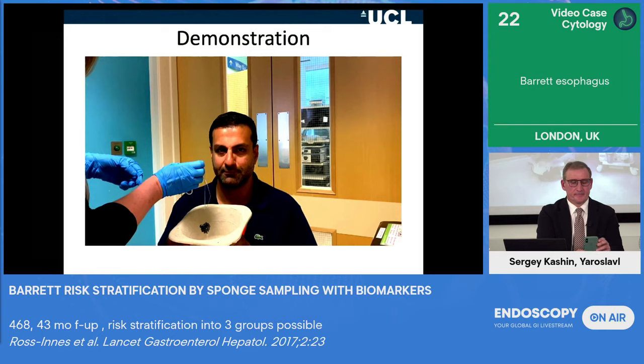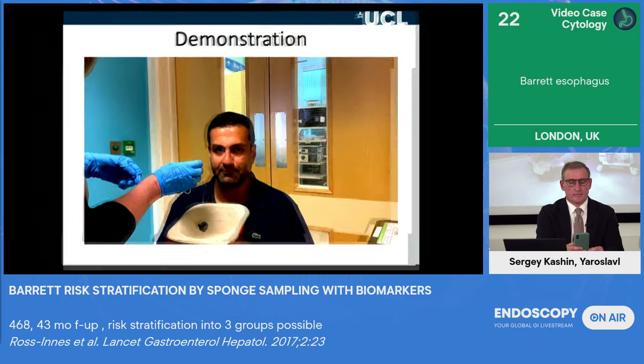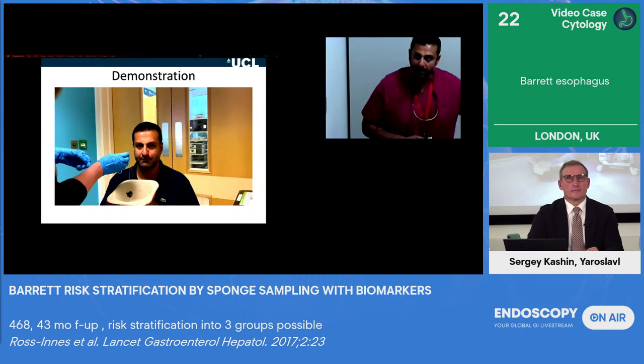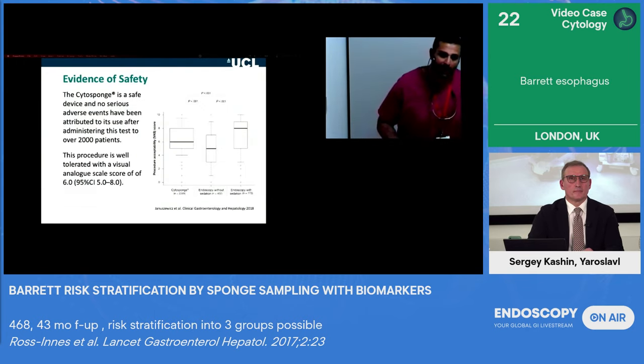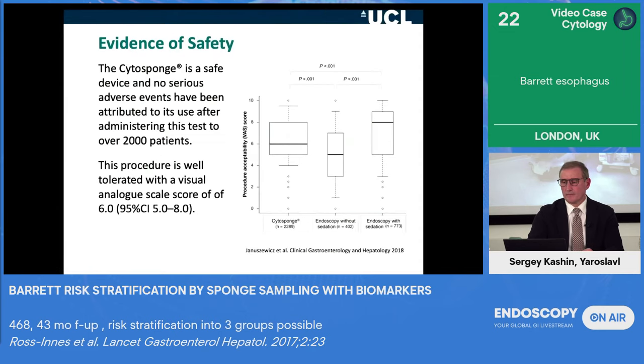And so the patient we're just about to show you very quickly before we go on to the next center, a gentleman who had a sponge for Barrett's surveillance, was never going to get his endoscopy, had a sponge which was positive, came back for an endoscopy that demonstrated a lesion that was resected, which was an M3 cancer. And he has come back now for radiofrequency ablation with RFA.